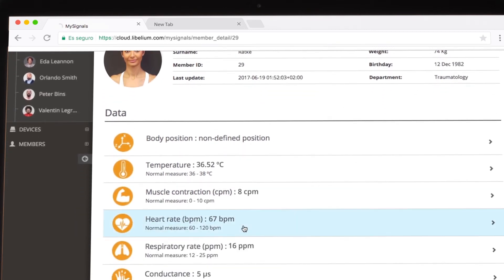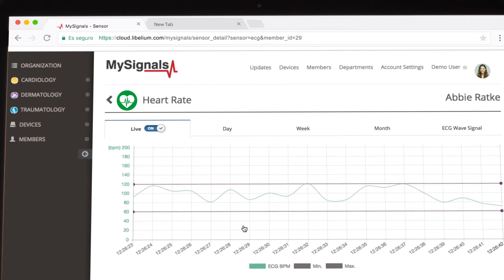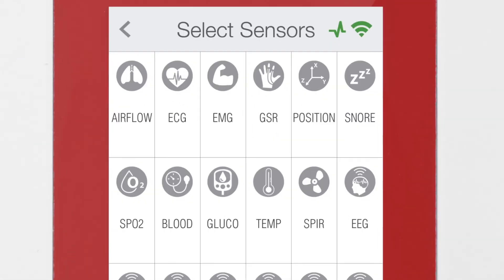Select the sensor you want to use to see the data. The Airflow sensor, the EMG sensor, the ECG sensor, and the Snore sensor are able to work with the RAW mode.